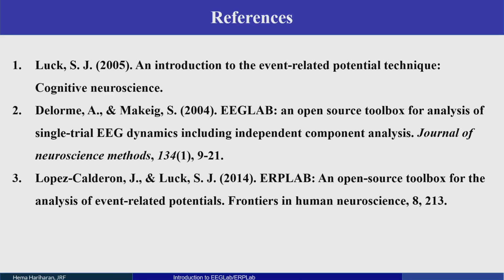Next I will give you a short presentation and a demonstration of how to do the AEP analysis. Then there are various other ERPs, like the P300, MMN, and VEPs. Along with that I will give their presentations, followed by their demonstrations as well.